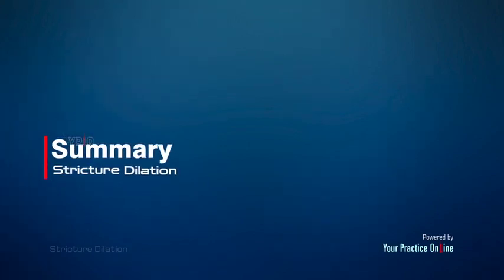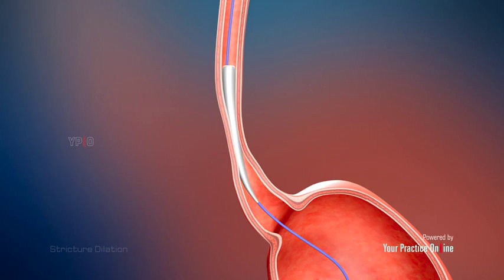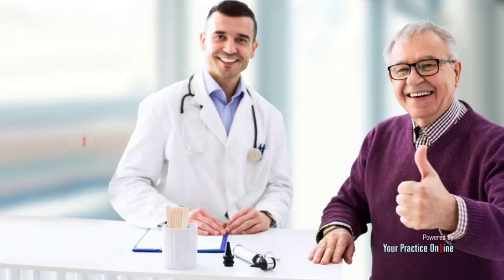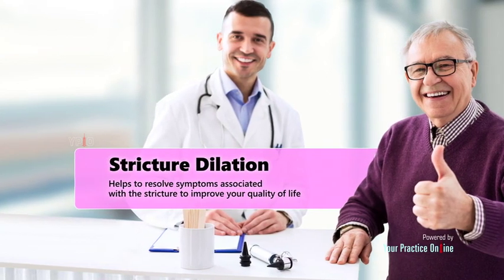Summary. Stricture dilation is a minimally invasive treatment most commonly employed for the treatment of esophageal strictures. It is a safe procedure and serious complications are rarely noted. The procedure helps to resolve symptoms associated with the stricture to improve your quality of life.